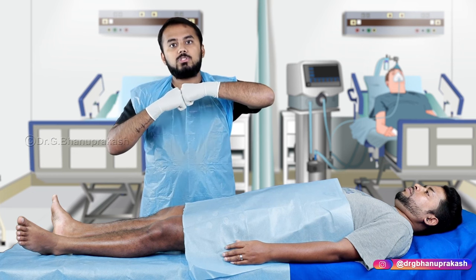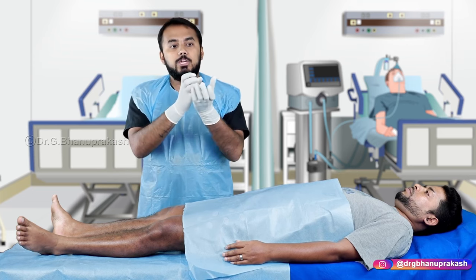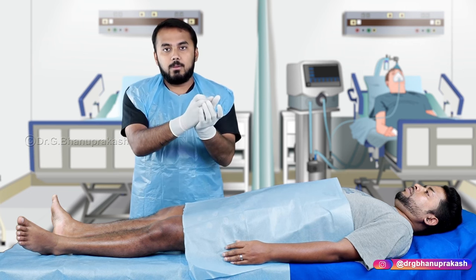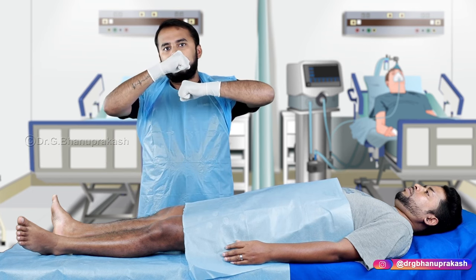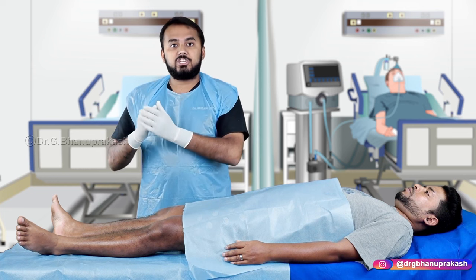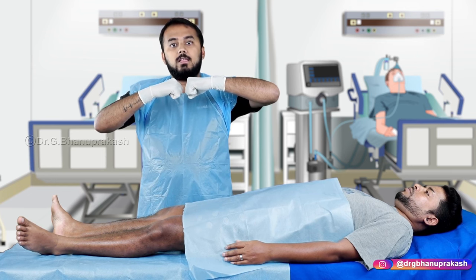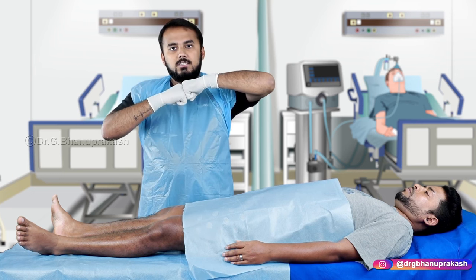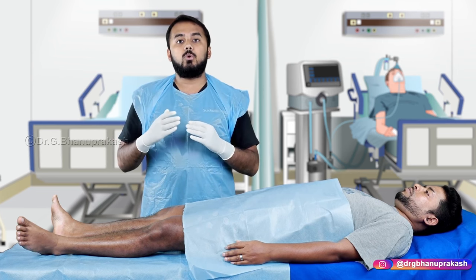To achieve reduction, two important things are needed: first, you need to apply proper traction — pull the leg if there is a lower limb fracture, applying force so fragments realign. Once reduced, you need to tie some material to immobilize the entire fracture site. This material is called POP — Plaster of Paris.